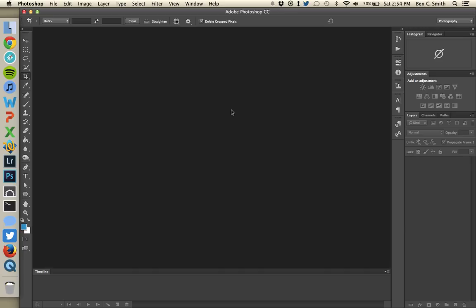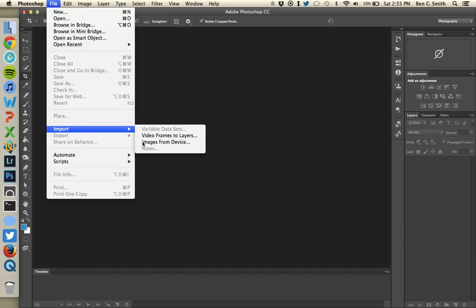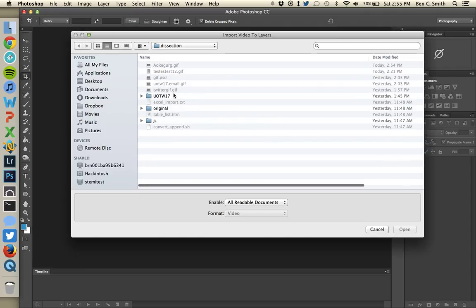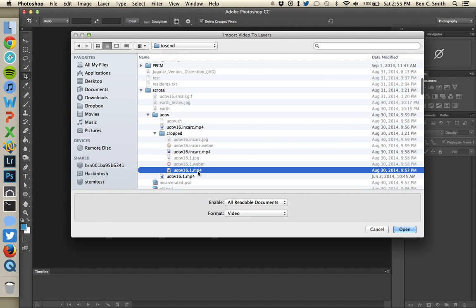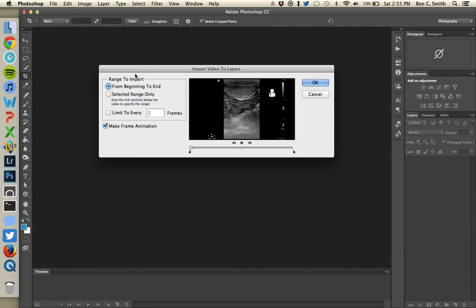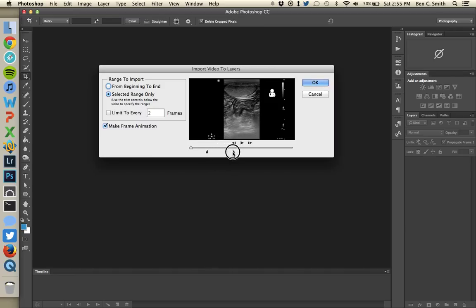I want to talk about one more instance of an ultrasound clip that's different from an echocardiogram. I'll go to File > Import > Video Frames to Layers to show you one more example. I have a good image of a testicle — I want to select Selected Range Only and Make Frame Animation. I want to capture an interesting part where you can see bowel peristalsis. For this technique, you only want to select a pretty small area — about one and a half seconds worth of clip. I'll show you why in a second.